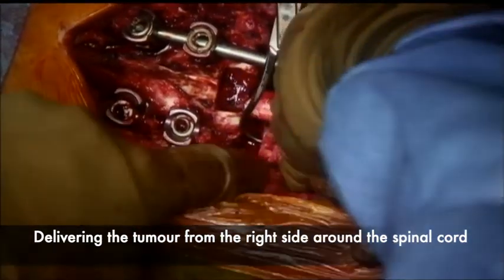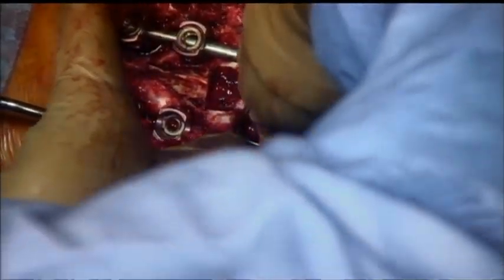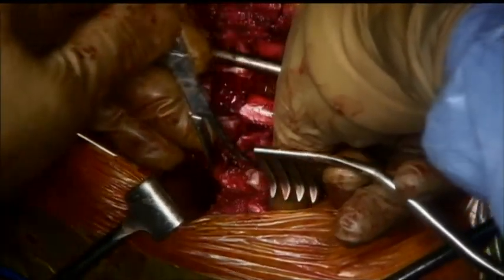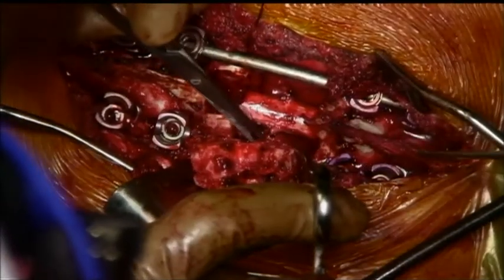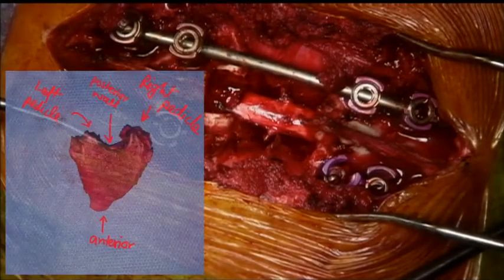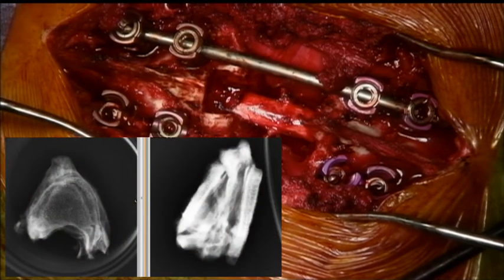This manoeuvre must be done very carefully without touching the spinal cord. Fingers are used to guide the vertebral body out slowly. Once it is out, any residual attachments are sharply divided and the tumor is removed. This is the photograph of the specimen removed en bloc, sent for histopathology for examination of the margins.